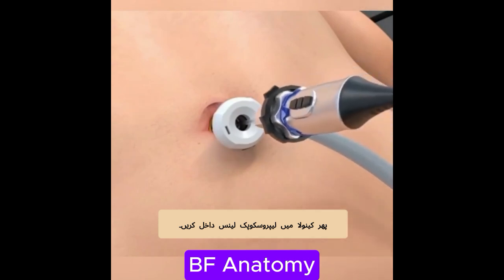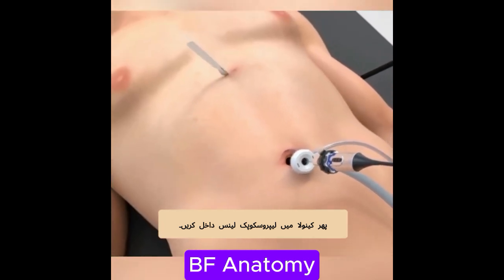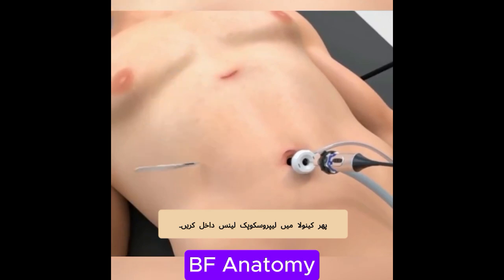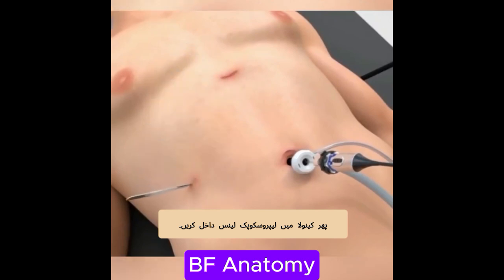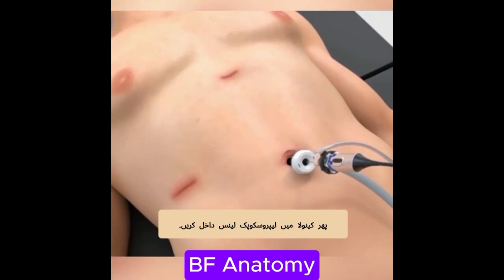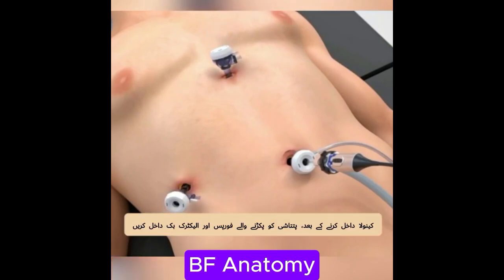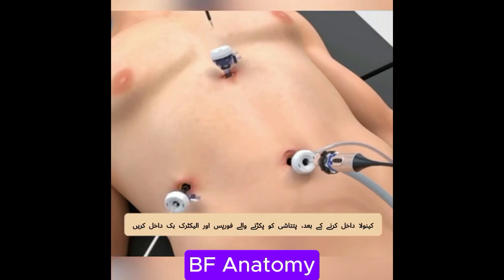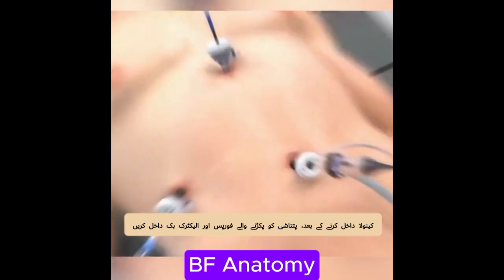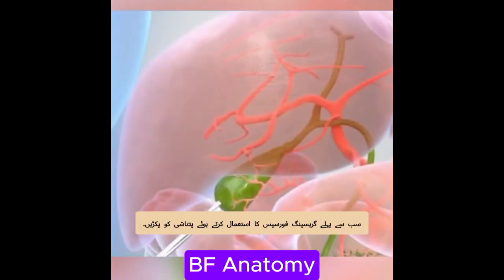The laparoscope is inserted through the trocar. Additional 0.5 to 1 cm incisions are made in the upper and right upper abdomen. Trocars are inserted, followed by the gallbladder grasper and electrocautery instrument.